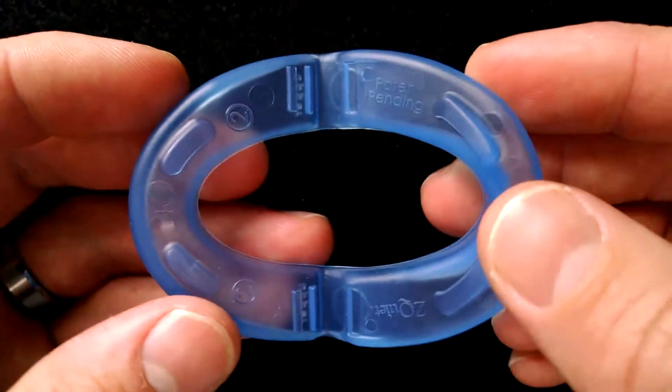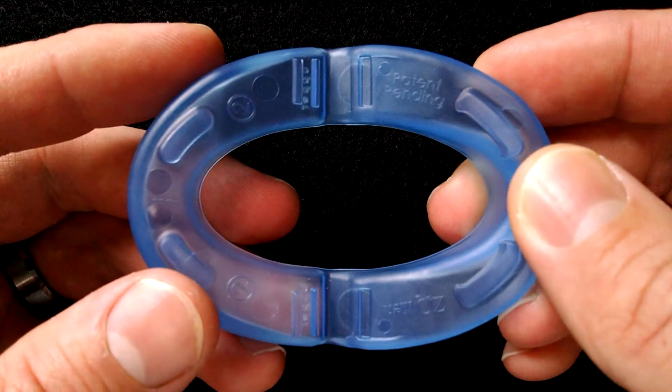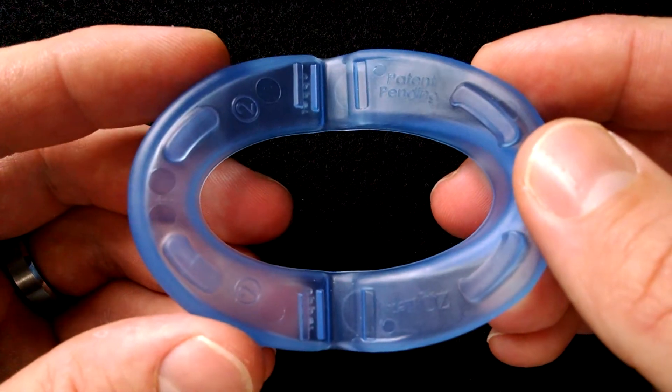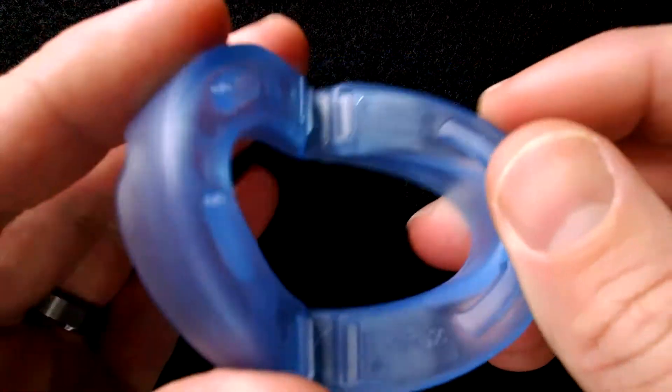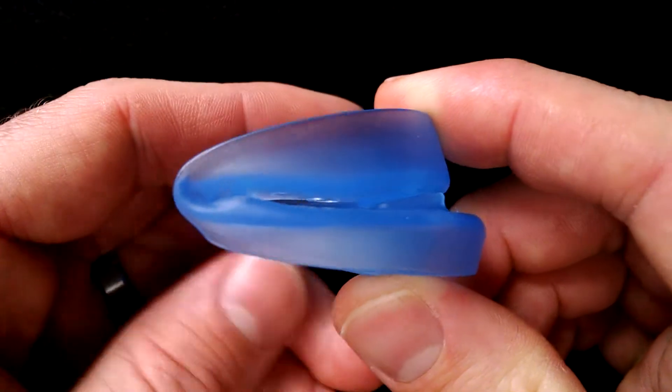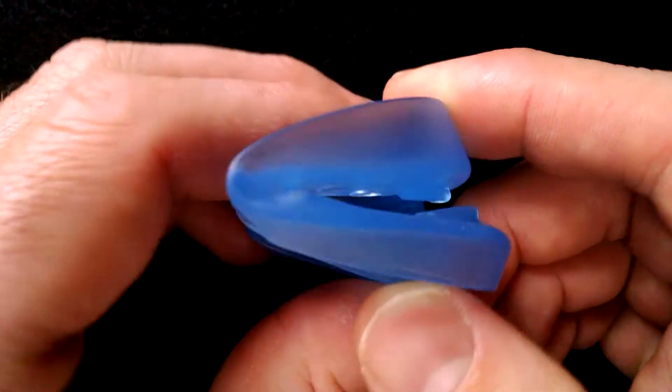The Z-Quiet is ready to use straight out of the box so you don't have to heat this up and custom mold it or anything like that. You simply rinse it off under warm water and then put it to use.